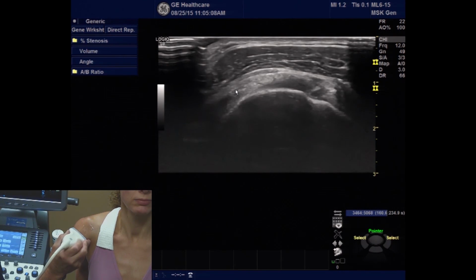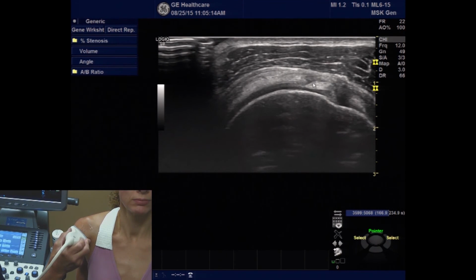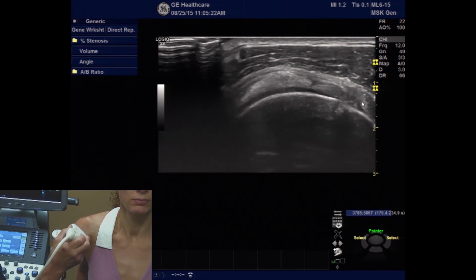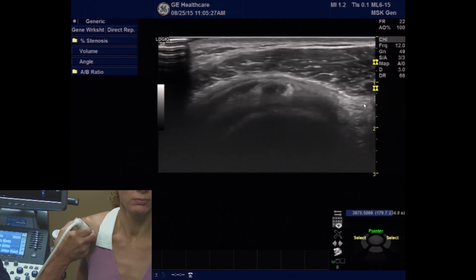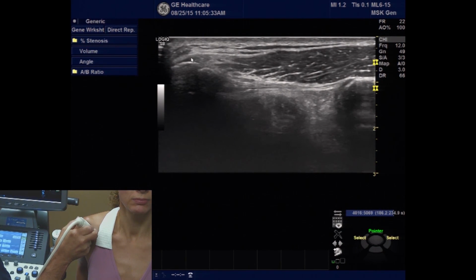Sliding the transducer back up, again we'll see the short axis of the supraspinatus tendon, the long head of the biceps tendon, the cuff interval, and showing the area of the subscapularis more medially. Follow that all the way back up until we pick up our bone landmarks of the coracoid process medially, the acromion laterally, and the coracoacromial ligament spanning the two bone structures.